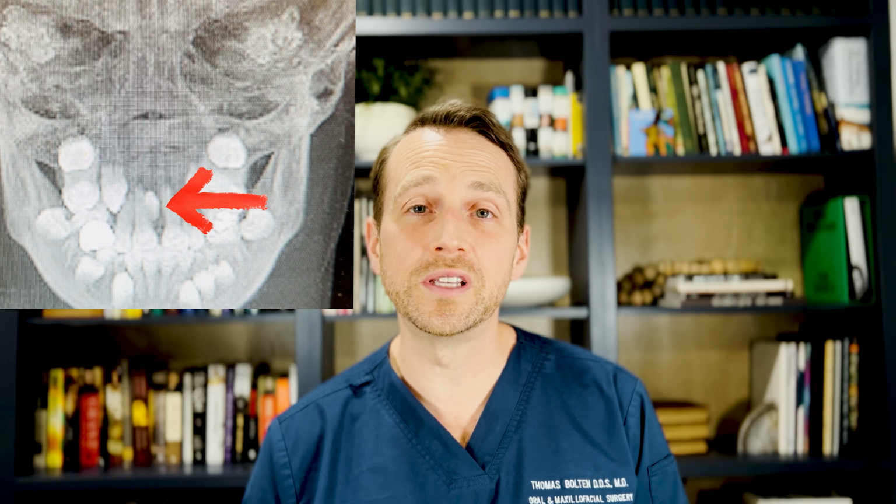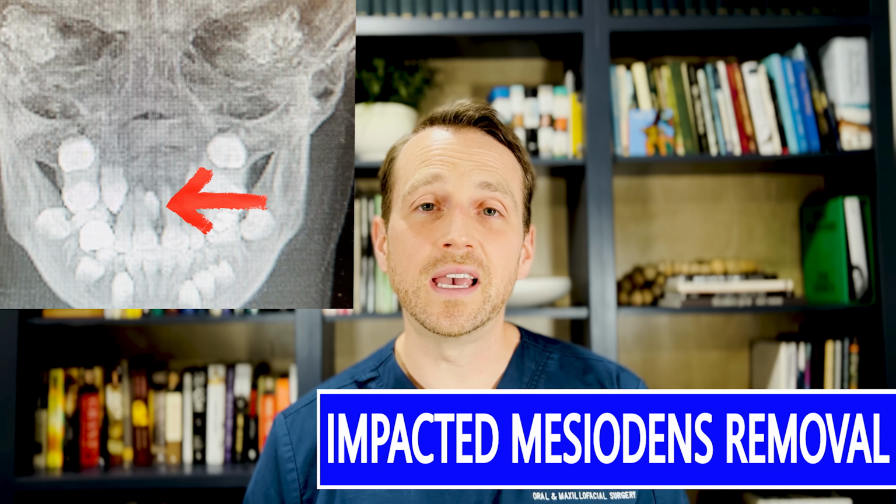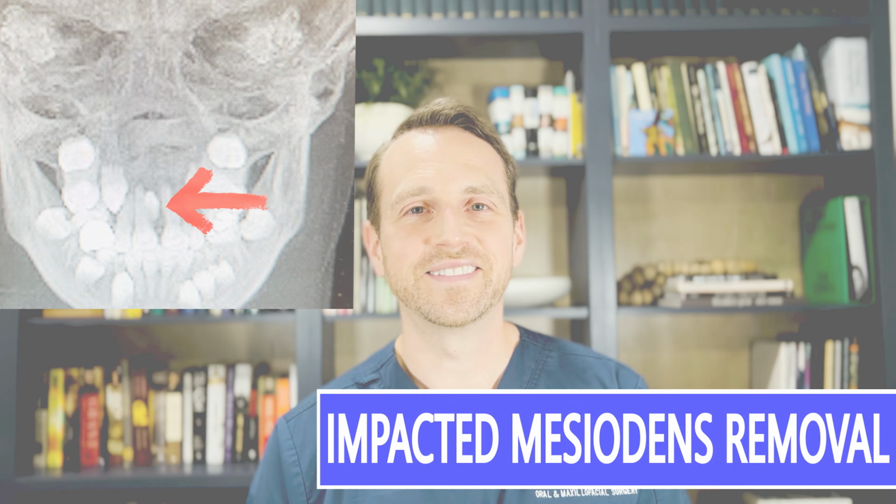A 10-year-old male comes in with a supernumerary tooth between teeth 8 and 9, the workup, treatment, and the surgical case today on the open reduction.